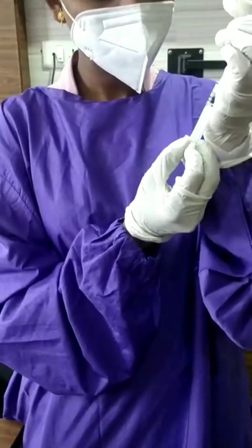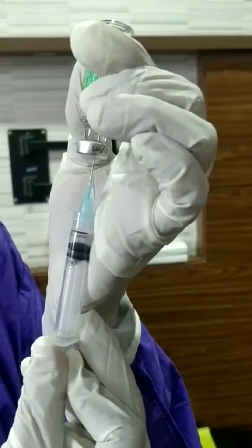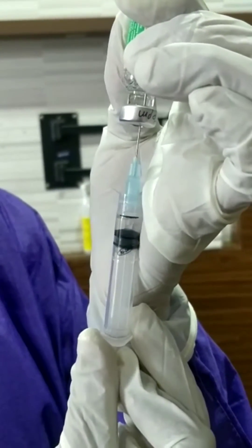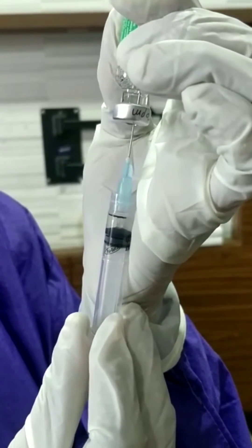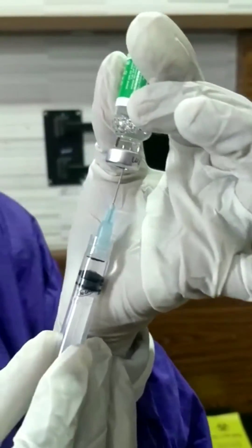Slowly withdraw up to the marking of 0.5 ml. When you withdraw, it has to be very slowly. Do not pull the plunger beyond 0.5 ml — if you pull beyond it, it will break the syringe.